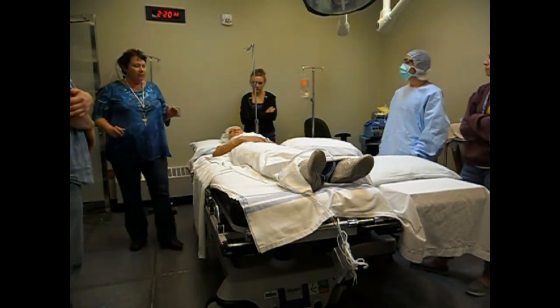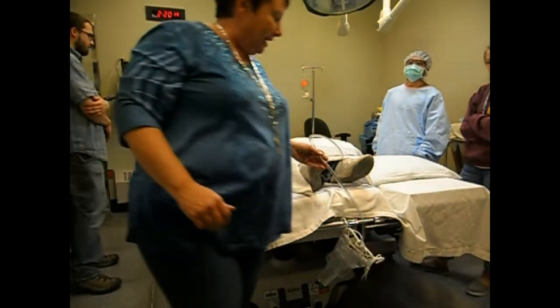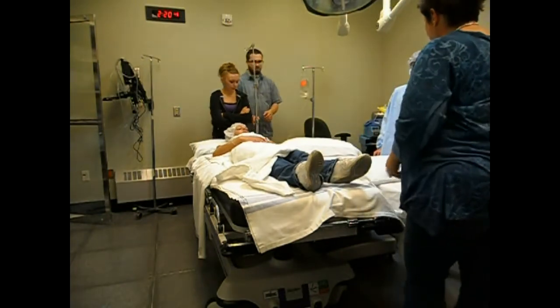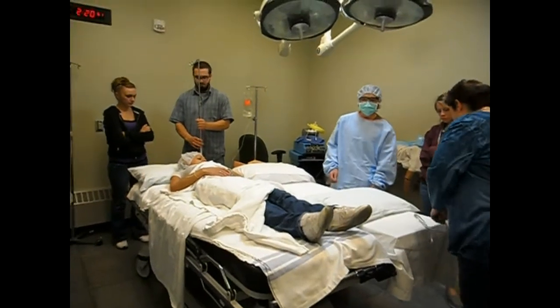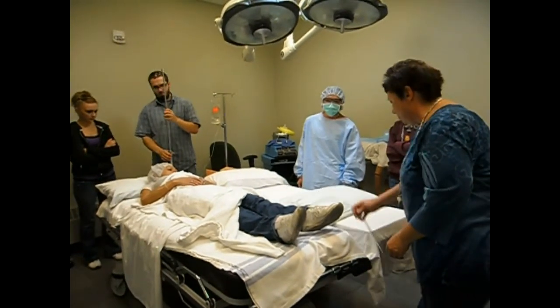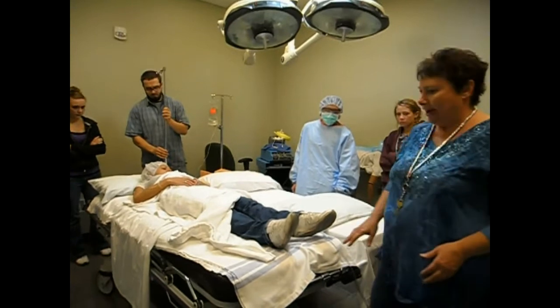Now, our Foley catheter we have to think about too, because she's going to be rolling over, and so we're going to want to have that detached from the stretcher and put onto the OR bed. Now, you have to think about this. This is going to end up over here. Her leg is going to come over. So we're going to put it on this bed right now. Now, be careful. Here's what happens. This falls down and it gets caught. So you always want to know where that is. And we don't want to have it underneath her leg. We want to have it just like that.